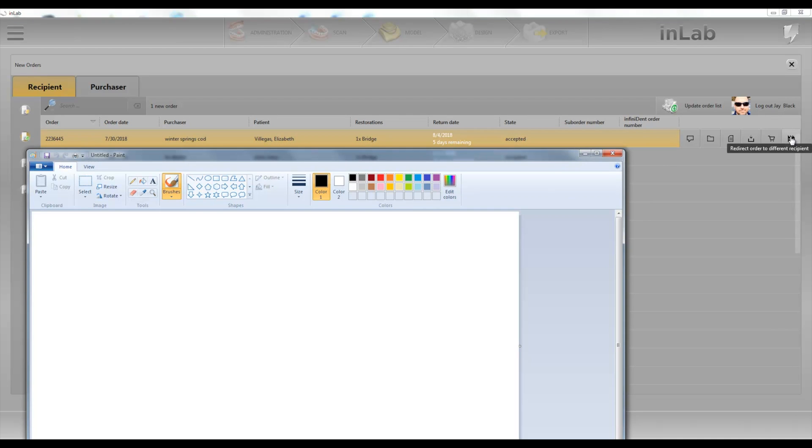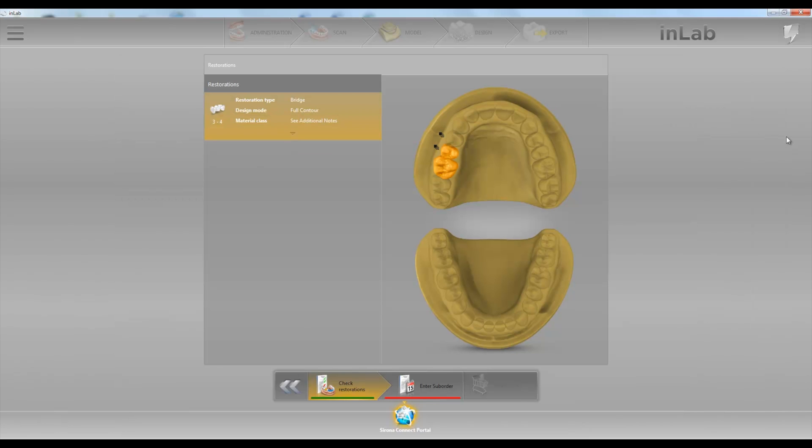So let's go ahead and click right here to redirect orders to different recipient. Okay, so now we'll go ahead and enter the prescription.